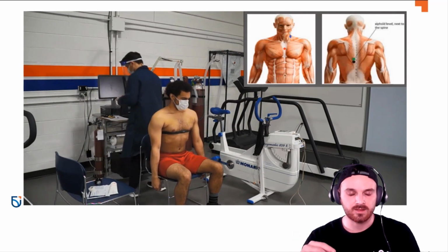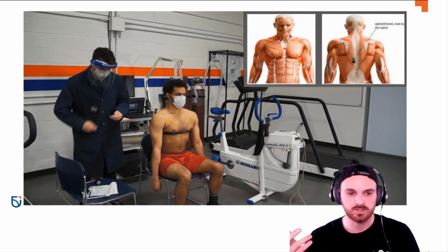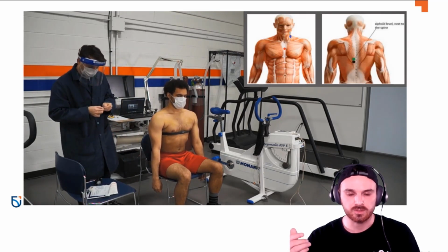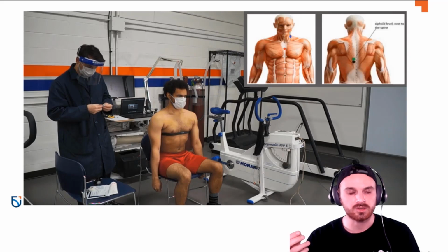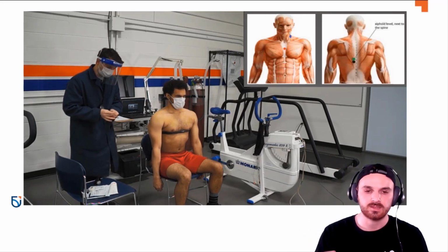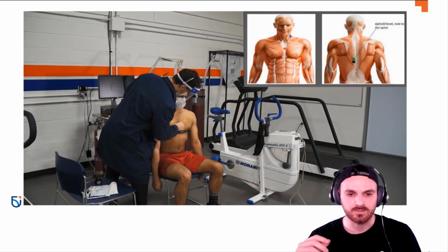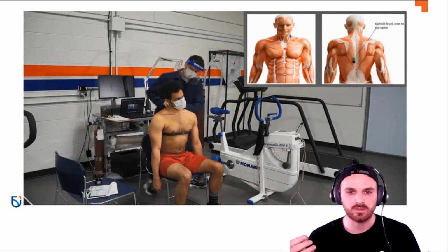Just waiting a second, I'll then grab a bunch of alcohol swabs. I typically like using isopropyl alcohol swabs because they're really good at cutting through some oils on the skin and helping wipe away some of that sort of grittiness. It's almost like a liquid sandpaper form. So it's kind of uncomfortable if you go pretty hard on the person.